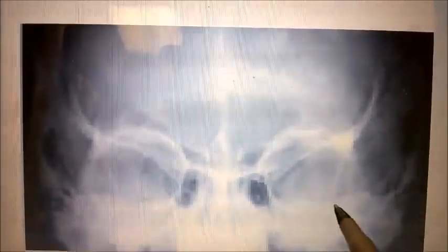Here we have a PA projection of the orbits, and it's a cone down. And why this is important is to look for any fragments or any particles within the eye or within the orbit, and also to make sure to have one orbit or eye as reference to another, to make sure that there is no abnormalities. And what we should see is the petrous ridges in the lower 1/3 of the orbits.